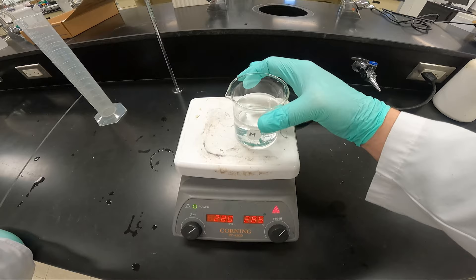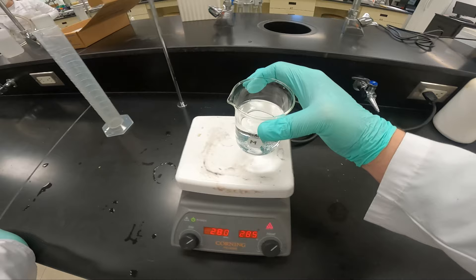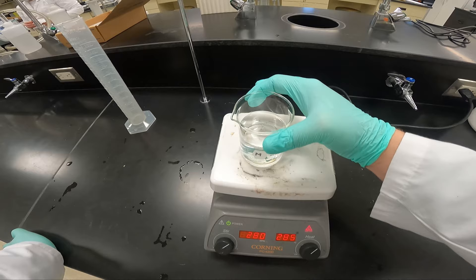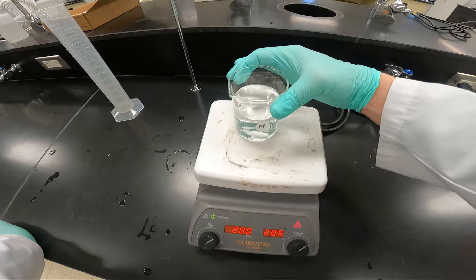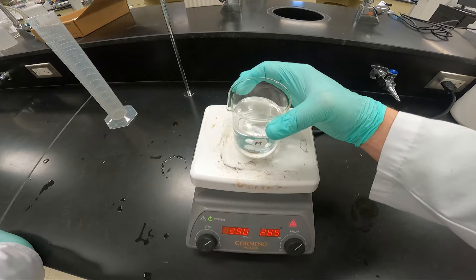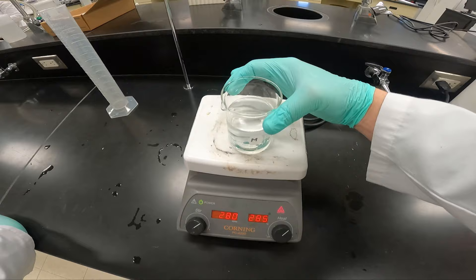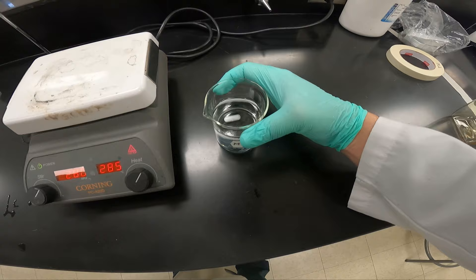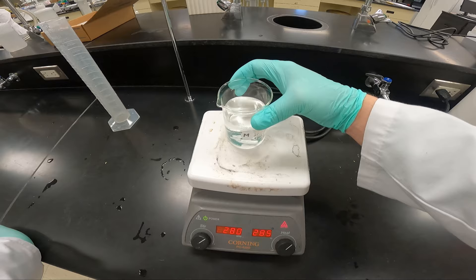If you preheat your hot plate, it will take a short amount of time. Notice how I move the beaker — by doing this, the magnetic stir bar goes around the edges. If you don't do that and it just spins in the middle, it will push the powder to the edges and it may not dissolve very quickly. As you can see, as I move it around, the stir bar spins around the edges, making sure it gets dissolved as quickly as possible. Once it is dissolved, turn the hot plate off immediately.